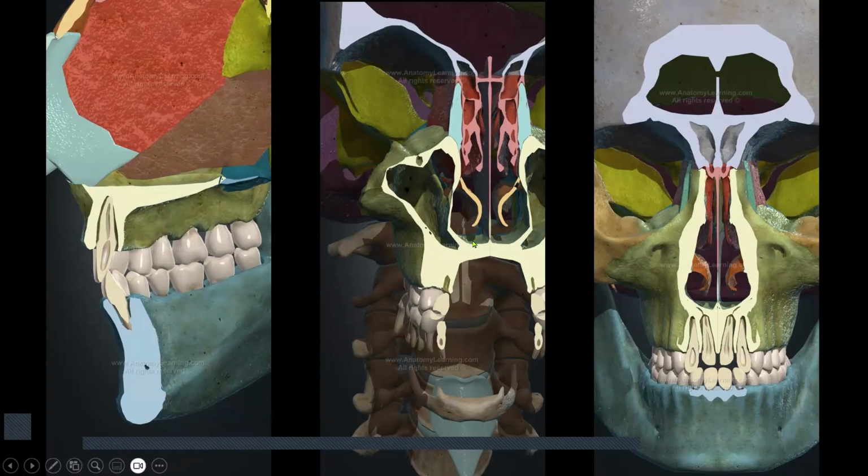So this is how you should know your target and how you will achieve the target. That is important. But right now we are discussing only the locations, because the planning and all of those things we will discuss in later classes. So in terms of location, in the anterior region, the nasal floor and nasal spine are the most important locations for the maxillary anterior region. In this slide also you can see this is the region where we have to engage the cortical implants.